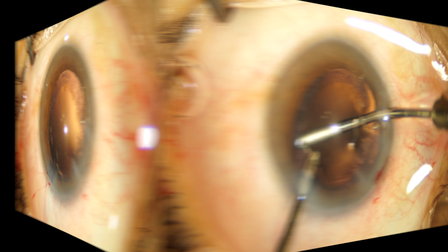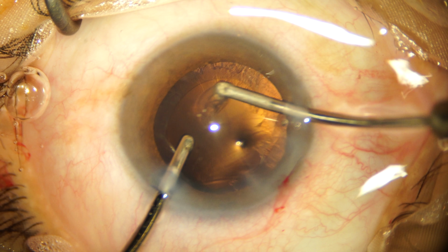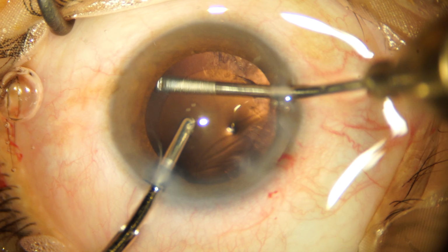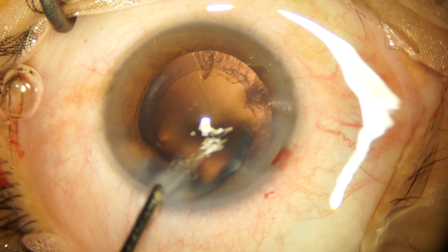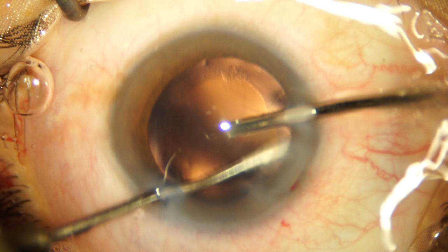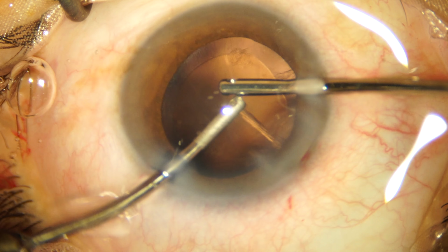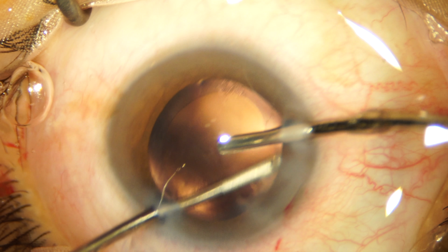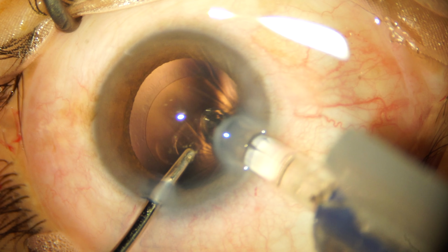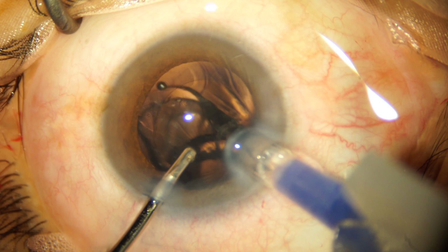So very little cortical matter is left, and this is easily removed with the bimanual irrigation aspiration technique. Using a sandblasted aspiration cannula allows you to further polish the posterior capsule to remove any small cortical remnants or the leftover epithelial cells. We are now demonstrating a hydro-IOL implantation under continuous irrigation.